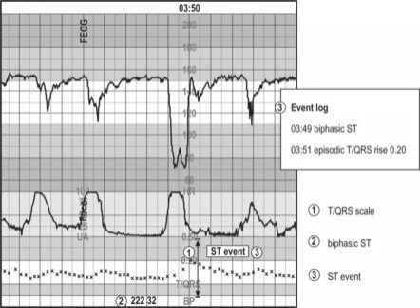Now, there were several more studies looking at fetal pulse ox, but I'm going to skip ahead to a Cochrane review from 2014. They included several trials, and they had similar findings. In all but one study, they found that although the number of cesareans performed for non-reassuring fetal heart rate tracing was lower with the addition of the pulse ox, it did not change the overall cesarean rate, and therefore they did not recommend its addition to labor management.